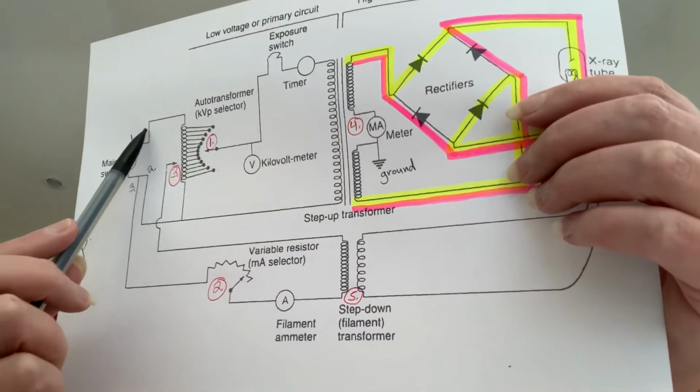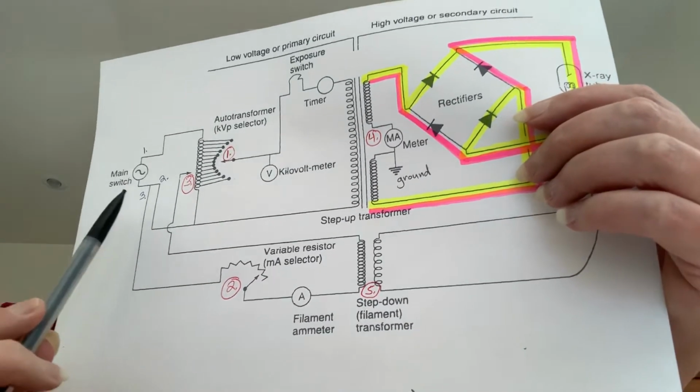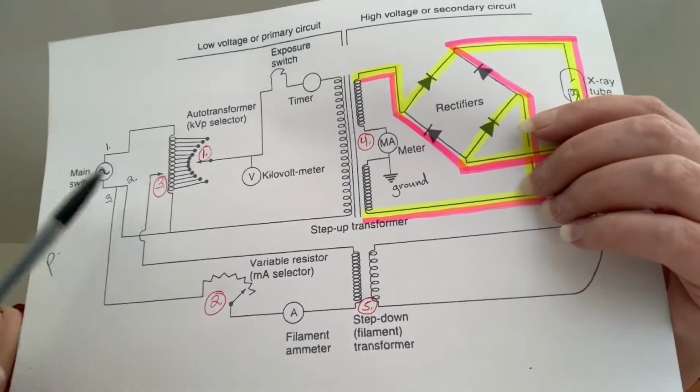Number 1 starts here. Number 2 is here. And number 3 is here. So there are 3 different lines. Now, of those 3 lines, lines 1 and 2 complete the cycle of the auto transformer. I'll show that later. Line 3 is not connected to the auto transformer. And the electricity flows in these 3 lines all at the same time, simultaneously.